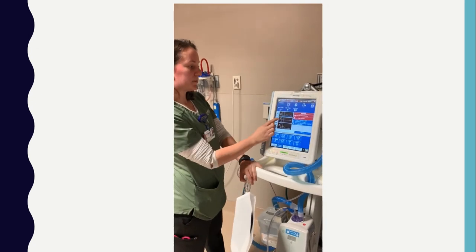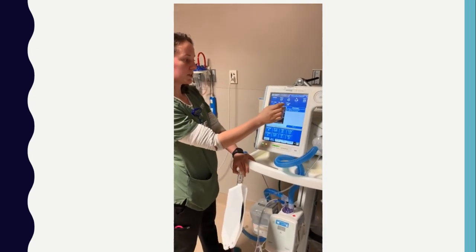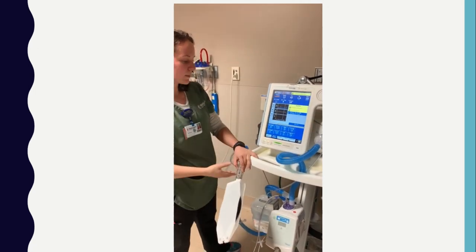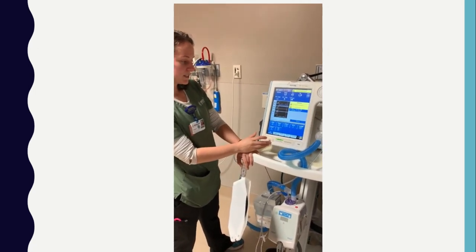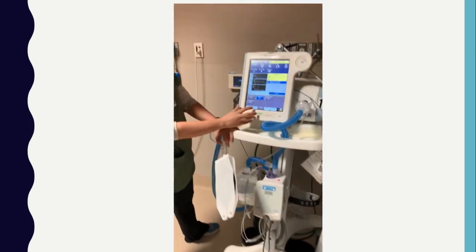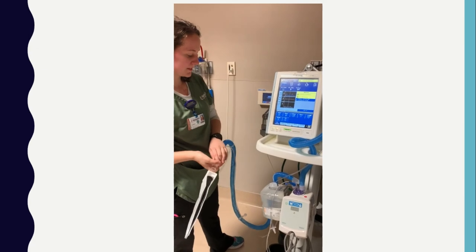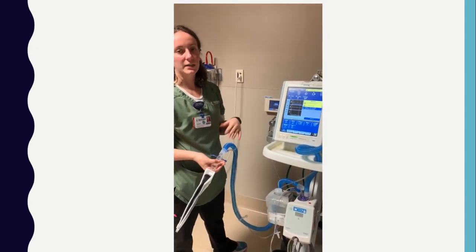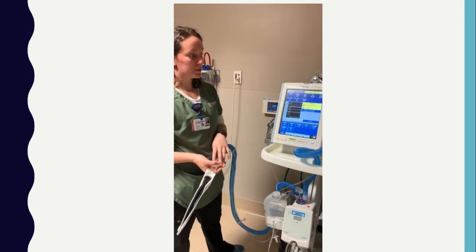Other than that, if you want to be able to see the full waveforms, you're going to reset your alarm right here, and these will go all the way across. That's about all on your BiPAP machines. Modes are going to be right here. ST is going to be your most common in terms of that. Same mask as our CPAP, same way they're fit and everything. So that should all be the same in terms of those.